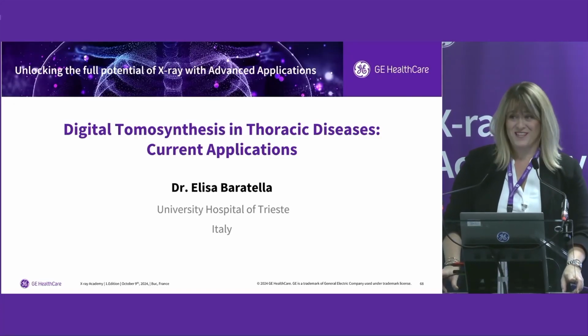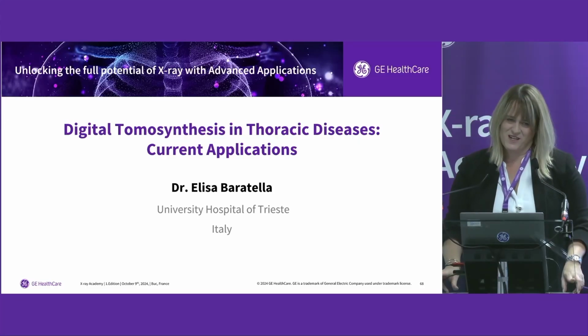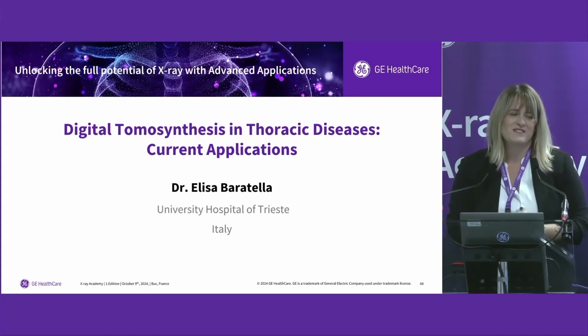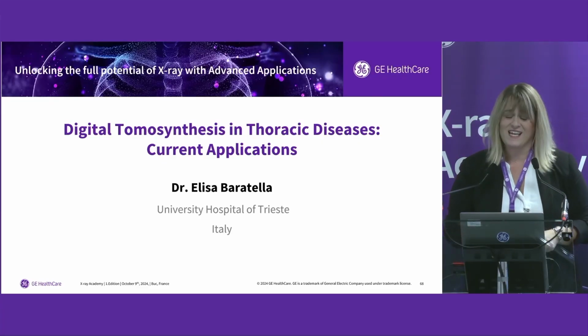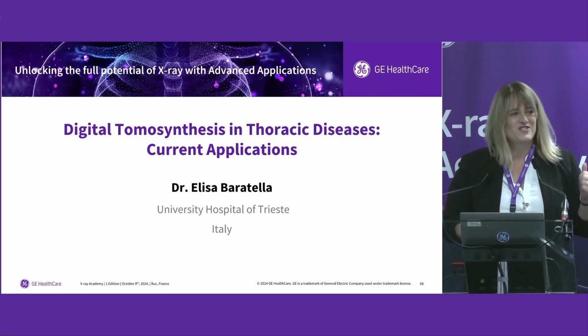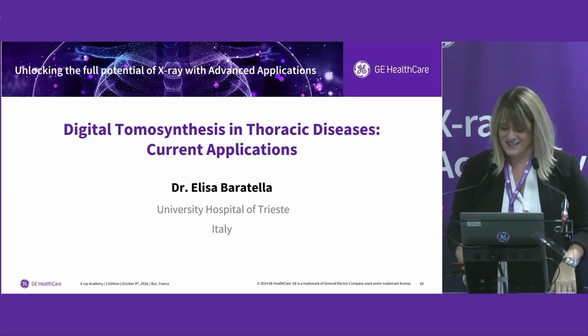It's a real pleasure because, coming back to 2008, our department in Italy was the very first one in Italy with a DTS equipment. So we have a very strong connection with the DTS. And my degree thesis topic was chest digital tomosynthesis. So I'm very connected with this technique.